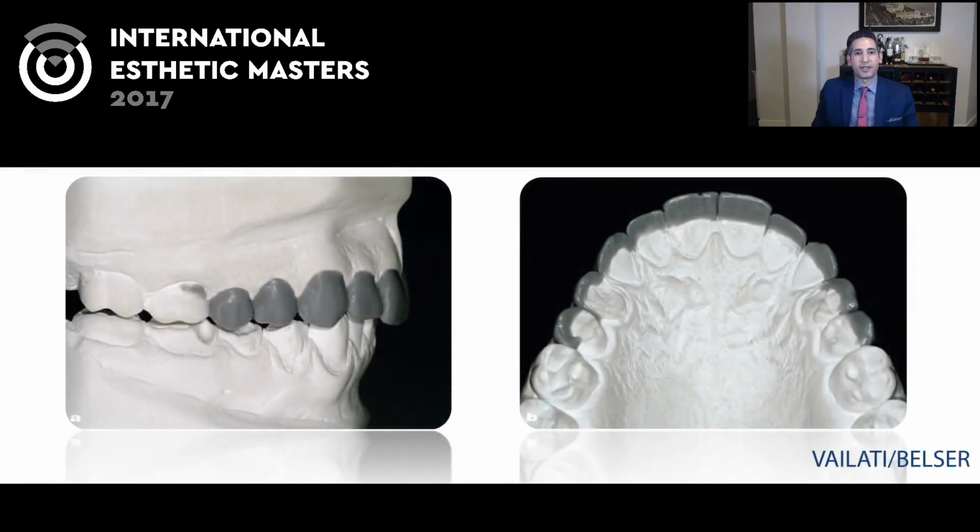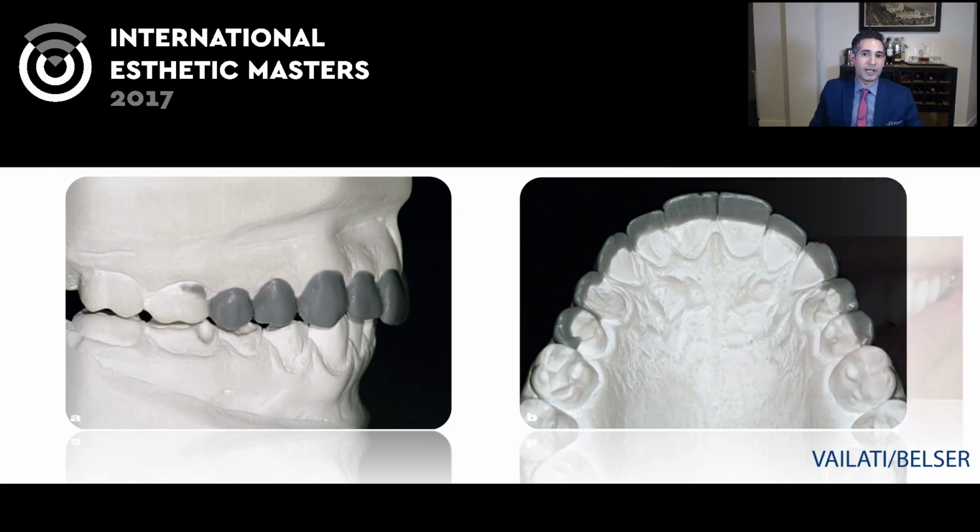So it starts with the wax up of just the facial aspect of the front 6 to 10 teeth, depending. Oftentimes 8 or 10 is ideal to get the full look, because you're going to get this wax up. The goal is to have no change in occlusion at this point, or no change in the lingual or occlusal surfaces, so that you can try it in on the patient.